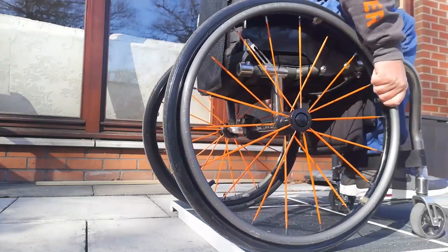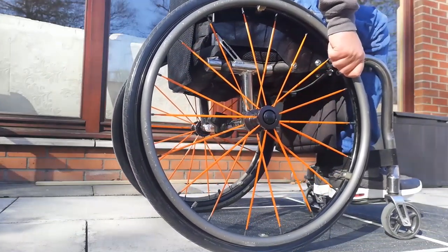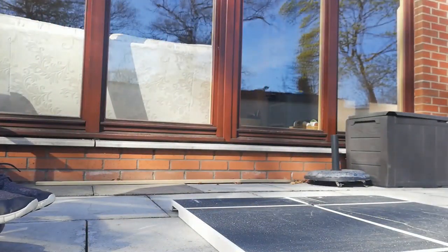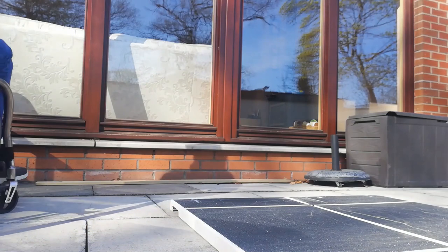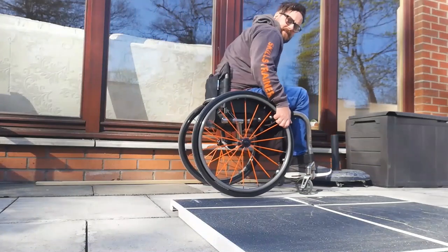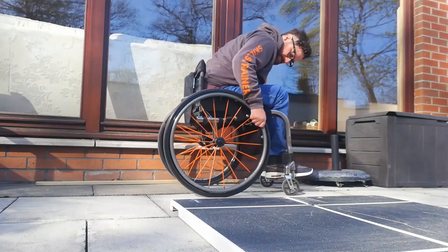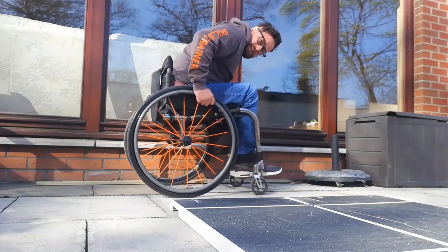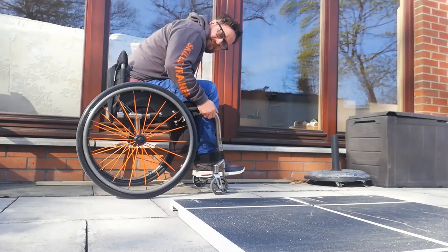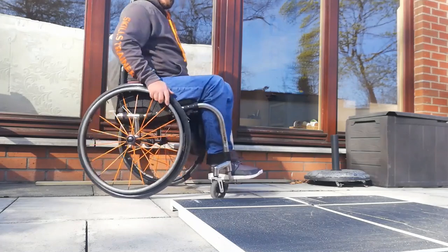As I come to the edge here, start to feel the chair go — let go, grab onto the push rims, and then once I've rolled away I can sit myself up. Just so you can see that from over here: it's coming towards the edge, getting that weight as far forward as you can, rolling and letting go, putting my hands on the frame. And then once I've rolled down and got onto the flat, that's when I can sit myself back up in my chair.